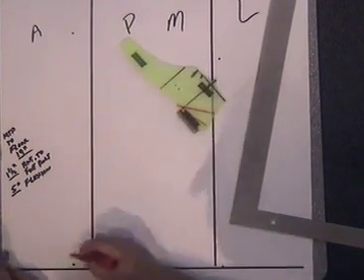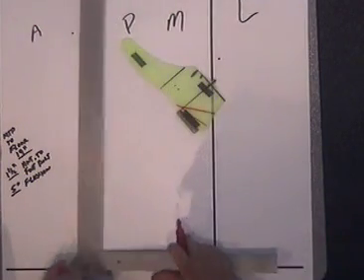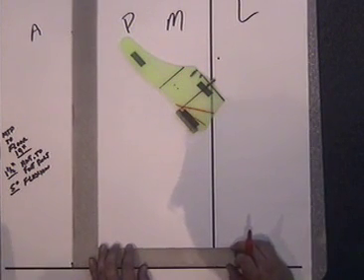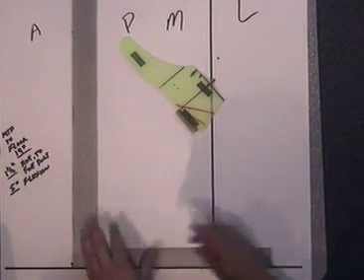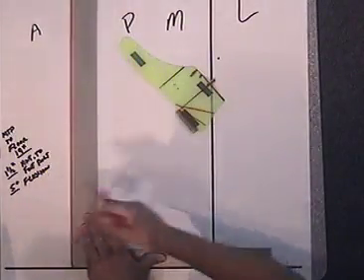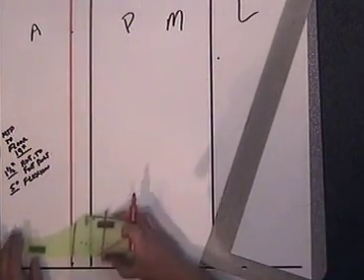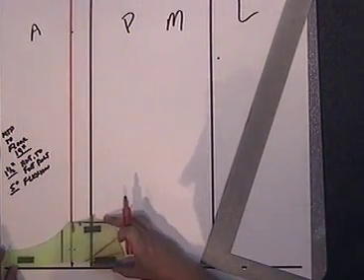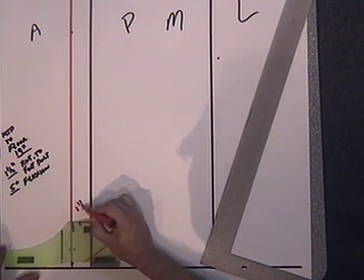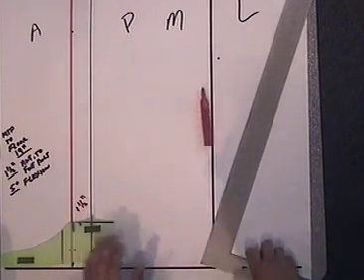I'm also going to make a line here 1.5 inches anterior to the line I just made that goes through the ankle bolt, and that'll represent my anterior placement of the socket over the foot. So done that, put my foot back down. You can see that this line is 1.5 inches anterior, 1.5 inches. Okay, so that's pretty good.